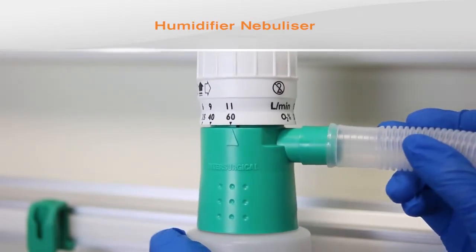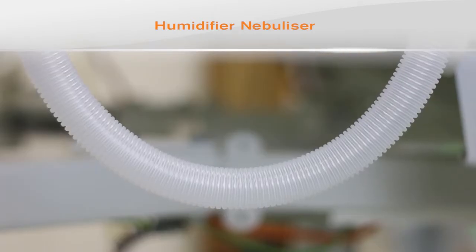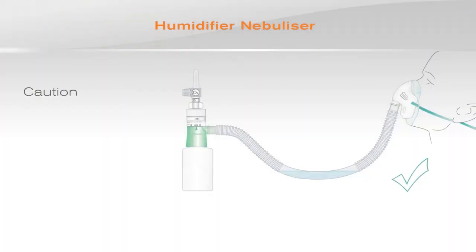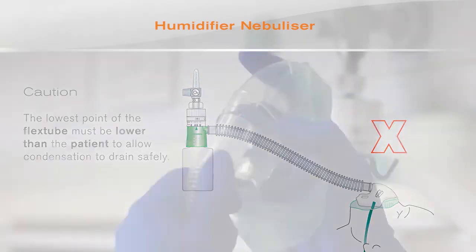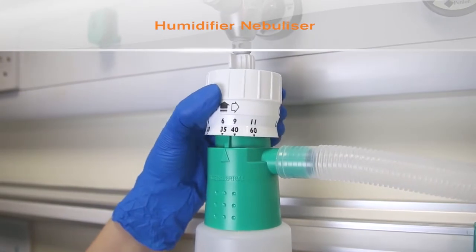Attach 22mm flex tube to the outlet of the humidifier nebulizer. It is important to position the tubing so that the lowest point is below the patient and to regularly drain any condensate, to prevent any condensed water from running into the patient or occluding the flex tube. Attach the aerosol mask and then adjust the oxygen concentration to the required level.